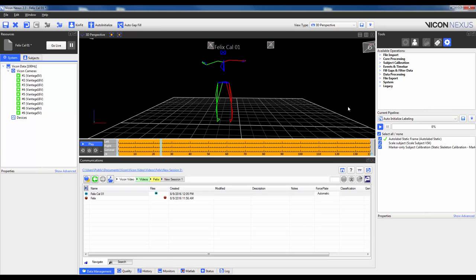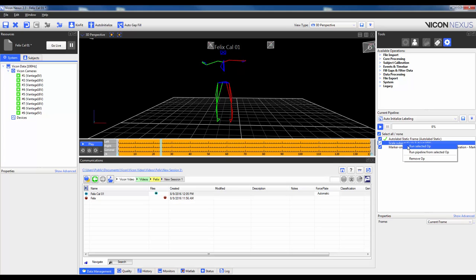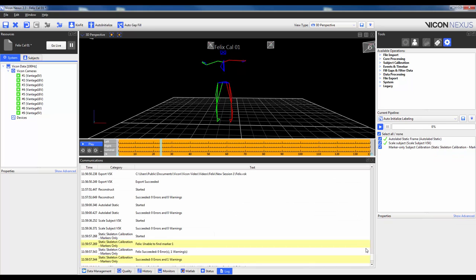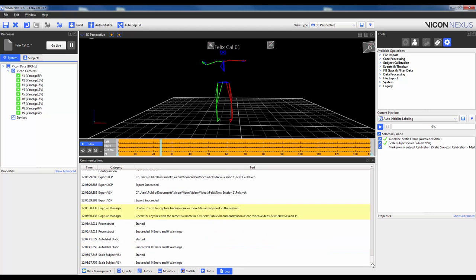The next operation is to scale the subject. This compares the current subject to the generic template and helps to scale the size of the subject using a single value. So I'll right-click and run Selected Op. You won't actually see anything here, but if I go to the log, I can scroll down and you can actually see that it has started and it was successful.